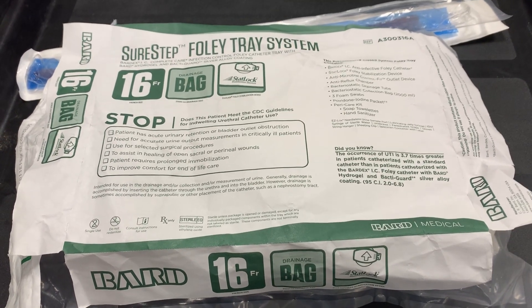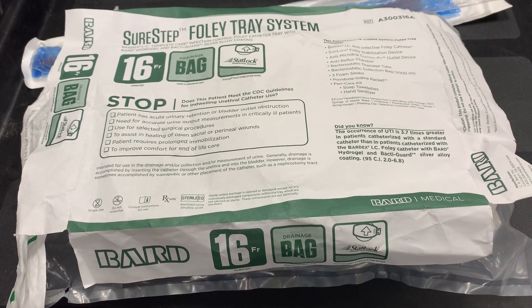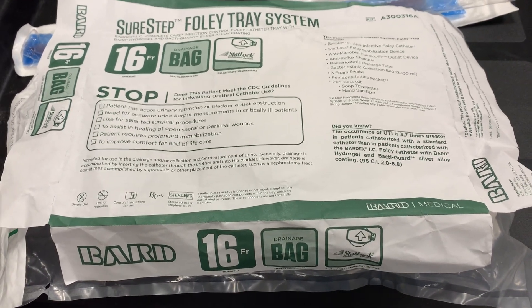Welcome to Shepherd Center's suprapubic catheter change instructional video. Today, we will be removing an existing suprapubic tube and inserting a new one.